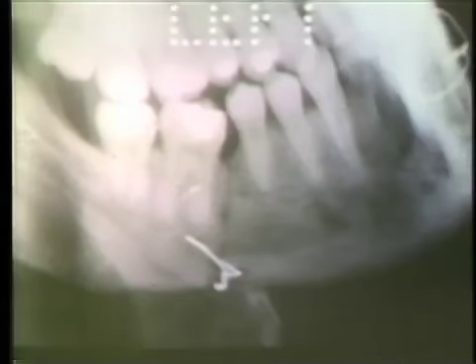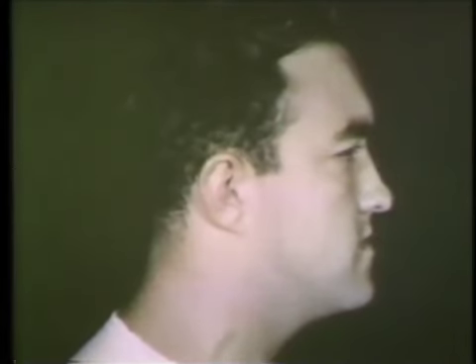The radiographs indicate that the position of the bone fragments is satisfactory. These patients do amazingly well. A return here to review what the pre-op conditions were like insofar as facial bone contour is concerned, and the malocclusion.